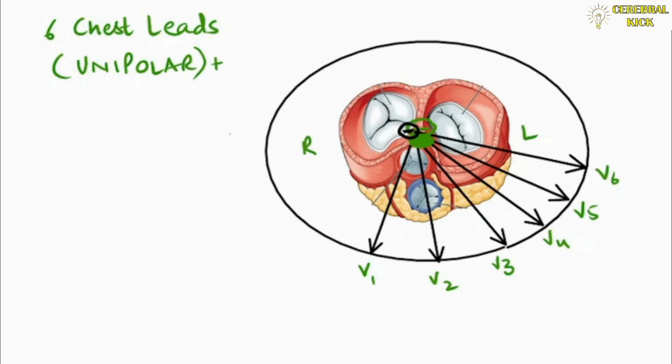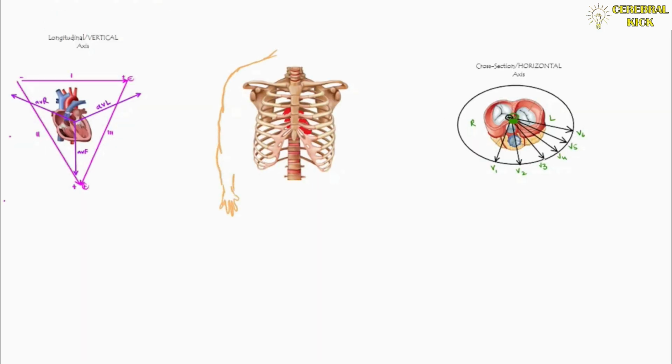Let's place the ECG leads now on a human being. Well, spare the details of the human being, seems to be quite fat for his age.